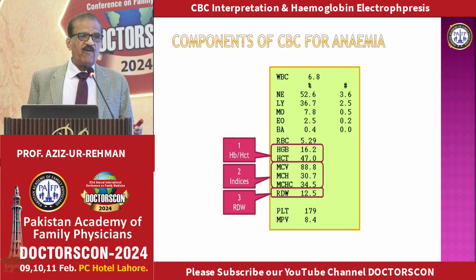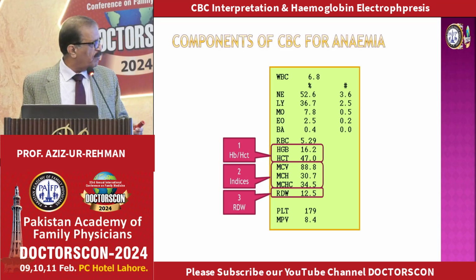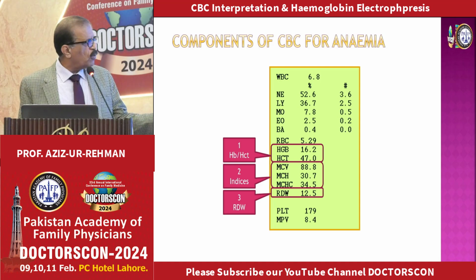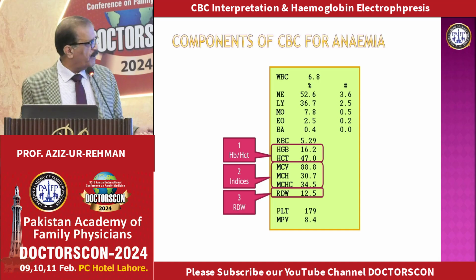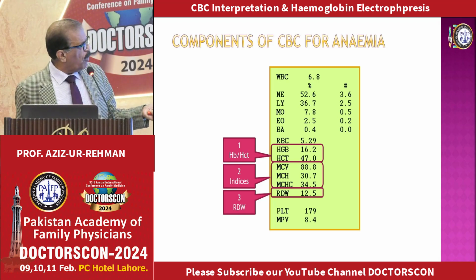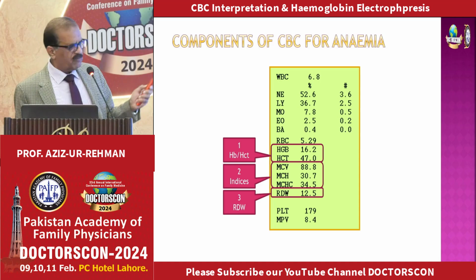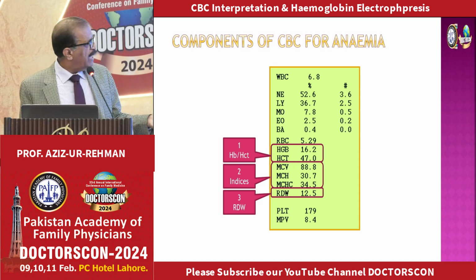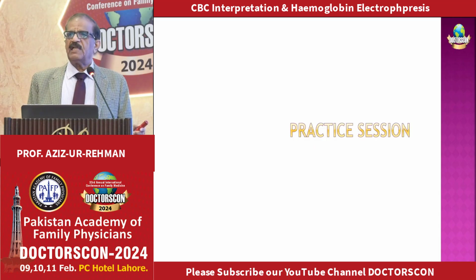The commonest anemia in our population is hypochromic microcytic, so I will be spending more time there. So these 3 steps, if you go through methodically, in the majority you will be able to come up with a proper diagnosis. In some cases, of course, in other hematological disorders, this would be important, like thrombocytopenia, thrombocytosis. In leukemias and aplastic anemia, this would also be important. But I'm going to restrict myself here. Now this is a little practice session.